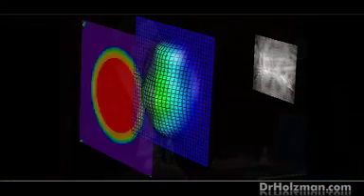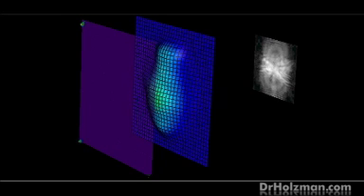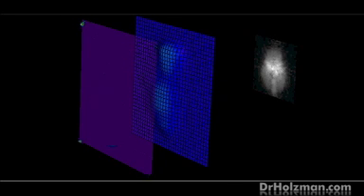This is a schematic of what a laser treatment will look like. Okay, so this is interesting. Picture that this is a point of light that you're looking at, but when your glasses are off, it's a blob of light. Okay, and this is what your vision problem is in a map form. So what's happening when the laser starts off is it starts off with a large treatment area, as you can see here. And what's going to happen is it's going to get the bigger problems first with this large treatment area. It's kind of like Mount Rushmore at the beginning.